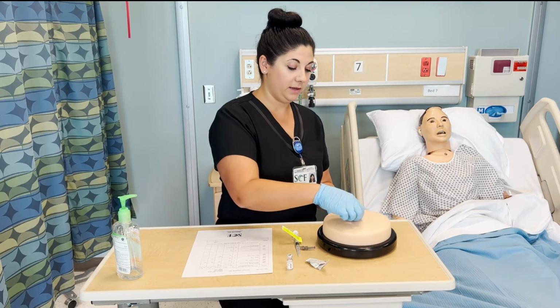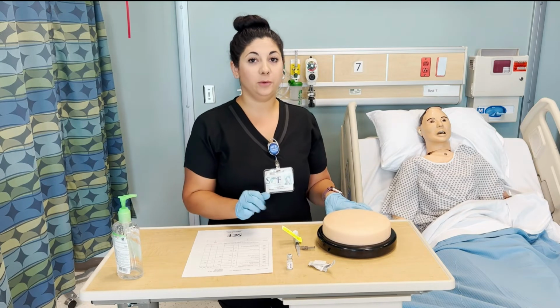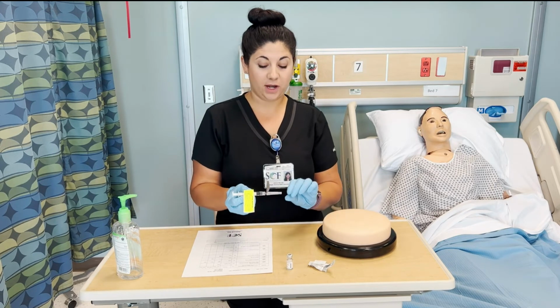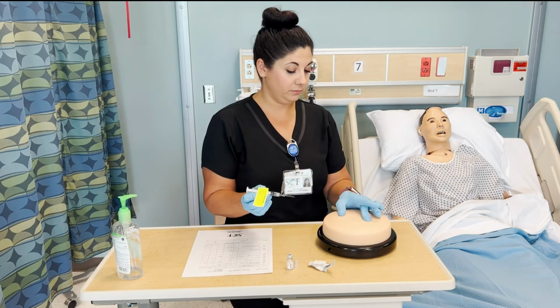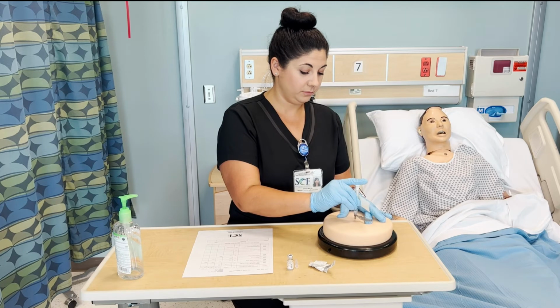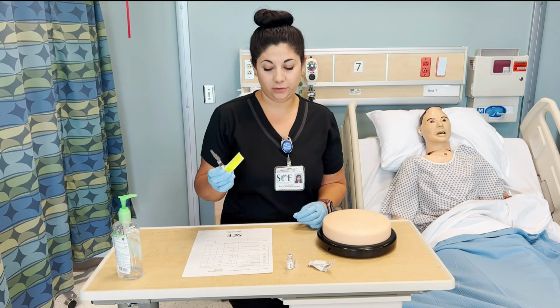Using my alcohol pad, I will clean the site starting with the center and working my way out. Let that dry without fanning or blowing it. Once it has dried completely, take off your needle cap, hold the skin taut, and inject at a 90-degree angle in a dart-like fashion. Slowly inject the medication and immediately safety your needle.